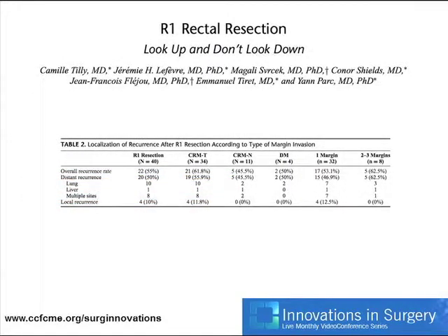So there is now increasing controversy in other areas of surgery as to whether or not we should be changing our patients' management based on the microscopic involvement of margins. And this was a controversial paper published in Annals last year out of a group in Paris. They make the point that, of course, cancer is a three-dimensional disease. The distal margin really is the true margin if you're going to describe an R1 involvement, but also, of course, in cancer of the rectum, we worry a lot about the circumferential resection margin, and usually 1 millimetre or less is deemed to be a positive margin.